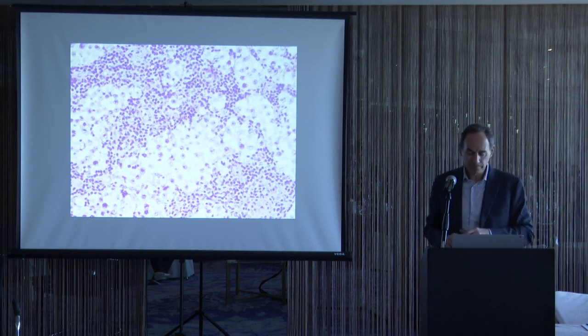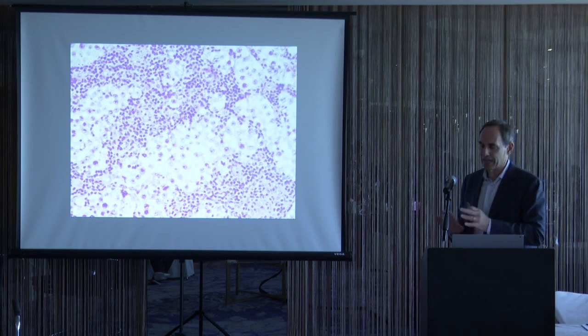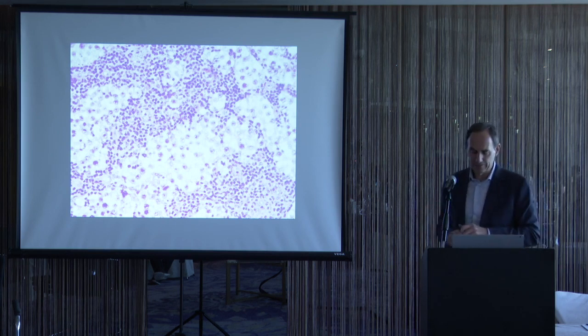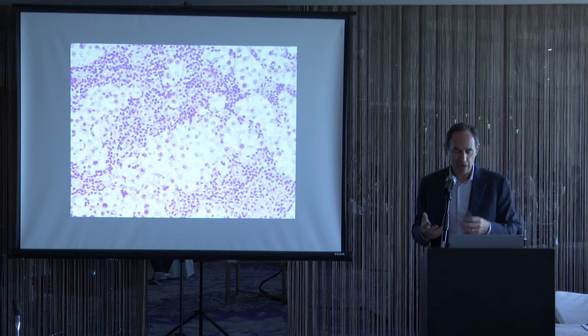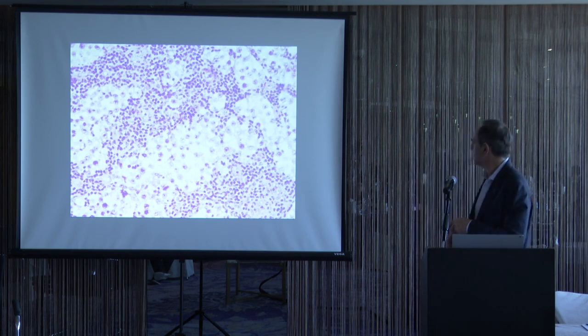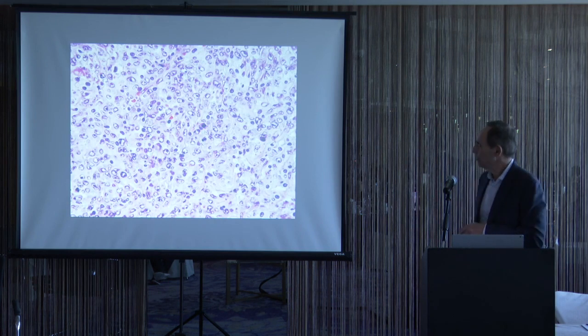Important distinction. Large cell lymphomas tend to occur in older individuals, but again, there can be some overlap in terms of the age, so you can't rely on the age. The key thing is seminoma cells, as we've gone through, are more uniform cells, rounded cells, more open chromatin. Lymphocytes look benign. Lymphomas, the nuclei are much more variably sized and shaped, not the nice uniform cells. You may see some sprinkling of lymphocytes, but these are much more pleomorphic.